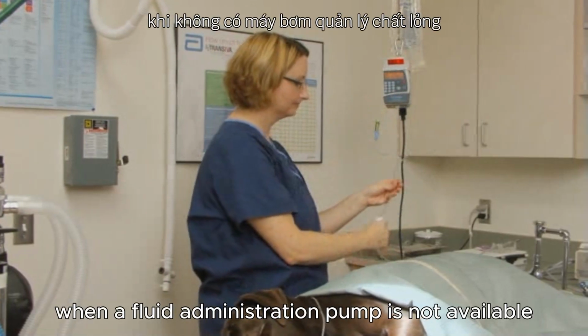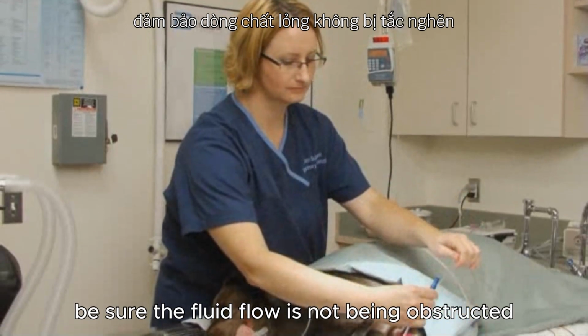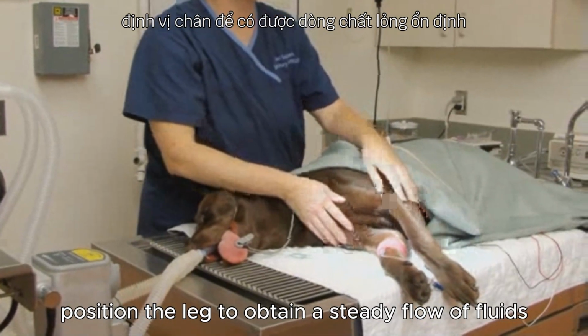When a fluid administration pump is not available, be sure the fluid flow is not being obstructed by the position of the patient on the table. Position the leg to obtain a steady flow of fluids.